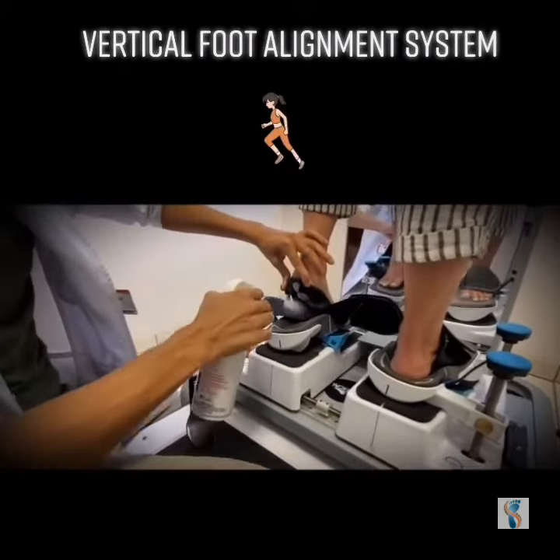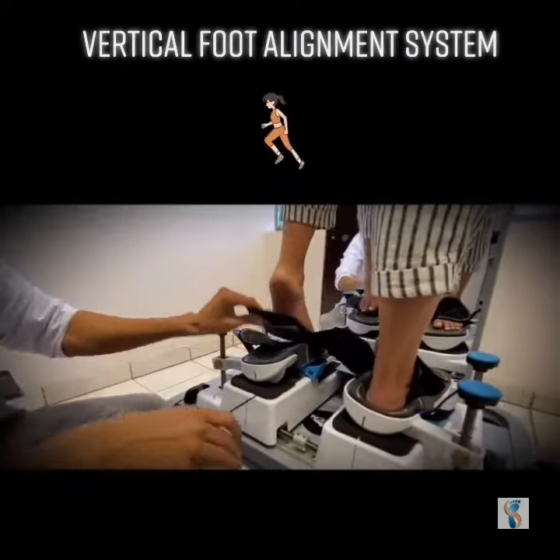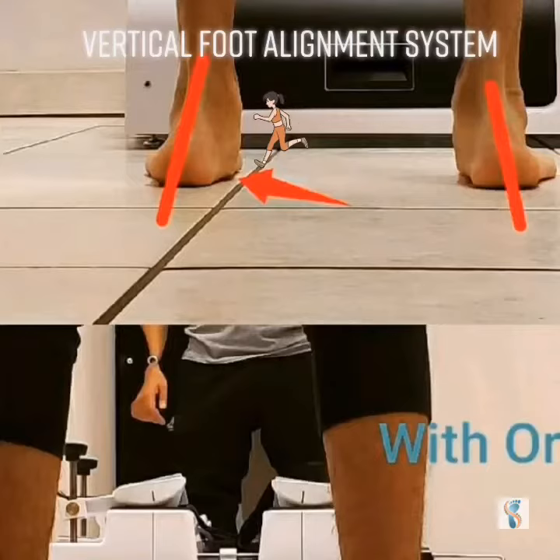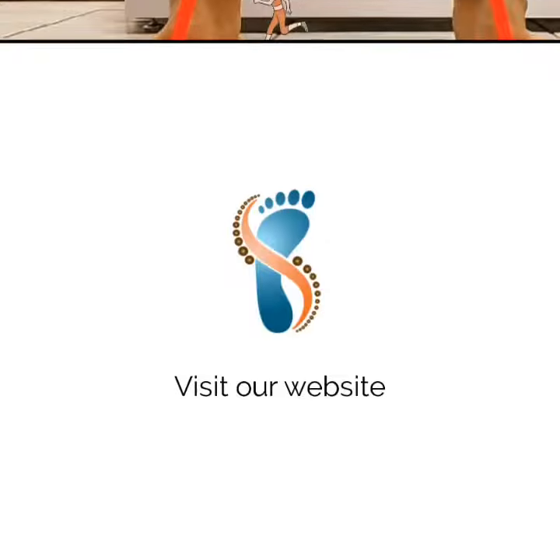In this image, you will be able to see how well the system allows us to mold the orthotics to the patient's foot while they're in a fully weight-bearing position. Not the same patient, but you can see the clear improvement in the patient's alignment.